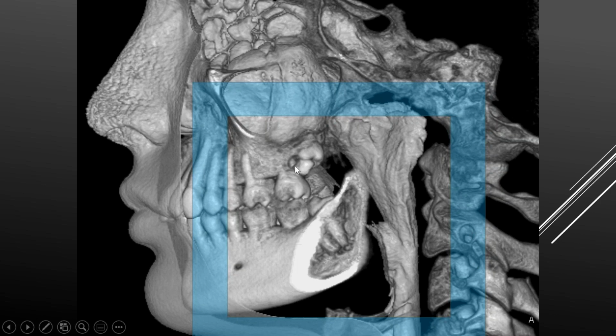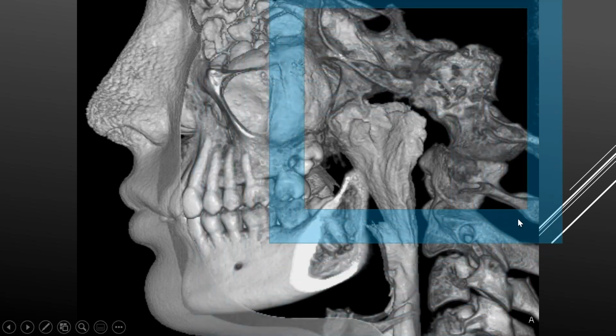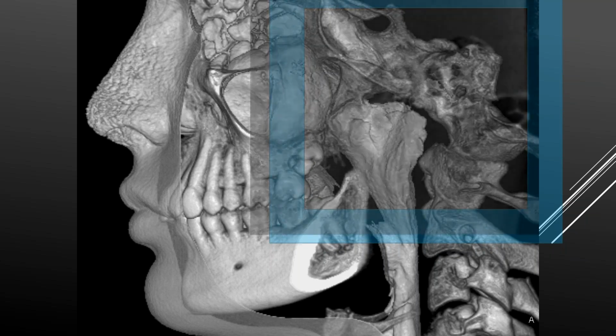By the way, interesting, there's a supernumerary tooth developing way out here in the buccal aspect, preventing 16, or for our international colleagues, 2-8, from erupting. And your buccal object rule and all those other things we taught you in dental school go away when you have a 3D rendering. So you can just find it. Now, for those of you who say, well, I've got a small volume, I'm not going to see the sphenoid sinus ever. Yes, you are, because when you move that volume around to take the temporomandibular joint condyle to see why the patient's having pain, of course you're going to be up there.